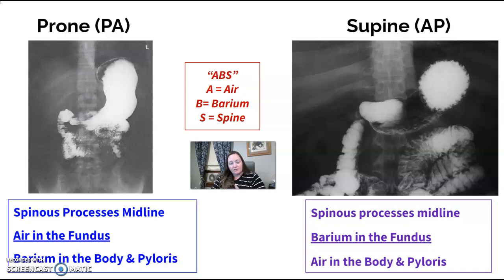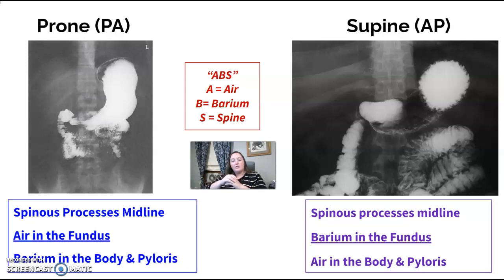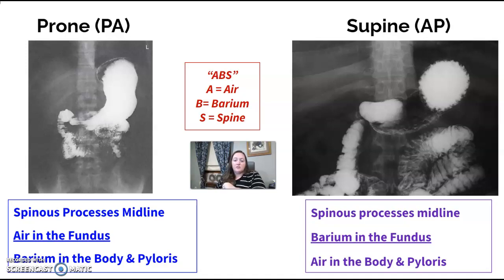Barium is a heavy liquid, and anything heavy or fluid floats to the lowest point. When your patient is supine, the fundus is sitting back farther toward the spine — it's the lowest point — so barium flows into the fundus. The body is raised up and collects the air. This is your supine image.